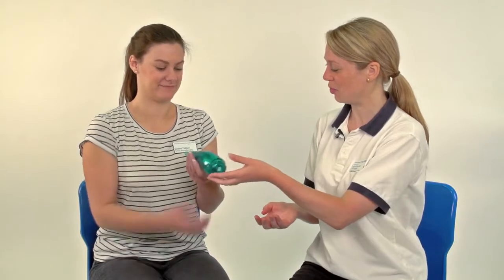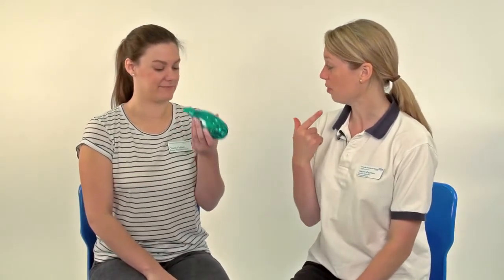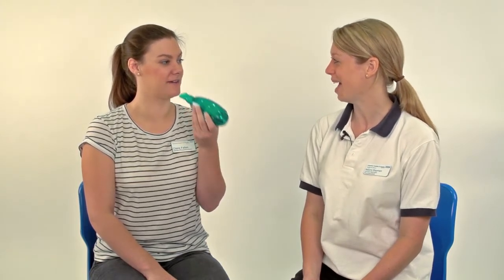So if you want to have a go — pop the mouthpiece into your mouth, creating a good seal so that there's no air that can leak out. Breathe in through the Acapella and then take a nice prolonged breath out — keep blowing, keep blowing, keep blowing and relax. How does that feel?